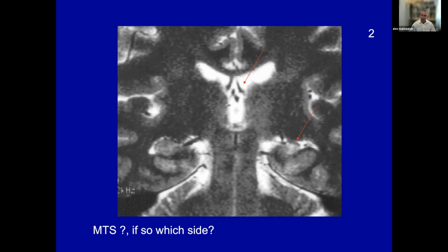Yeah, again, I can actually send you a list of what I think are ideal imaging for epilepsy. But again, you want to do T2 weighted thin section coronals. I think you should have FLAIR imaging in axial and coronal, and the coronals need to go through the entire brain, especially in adult onset seizures.